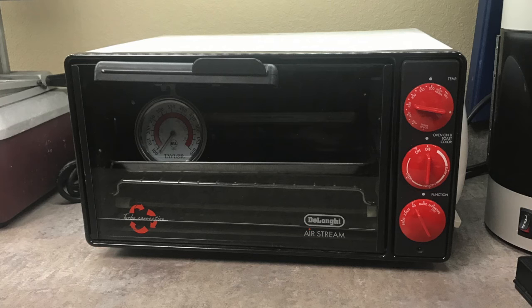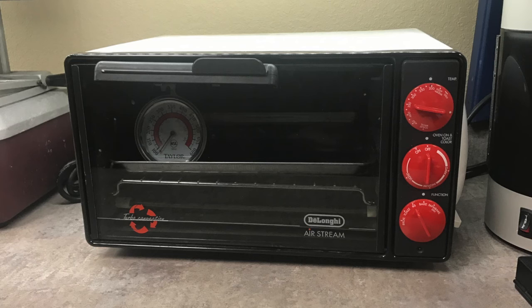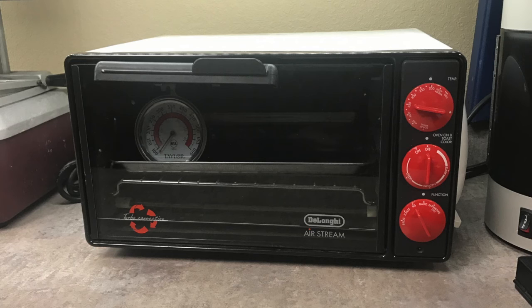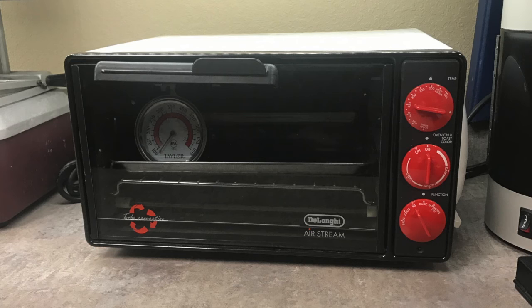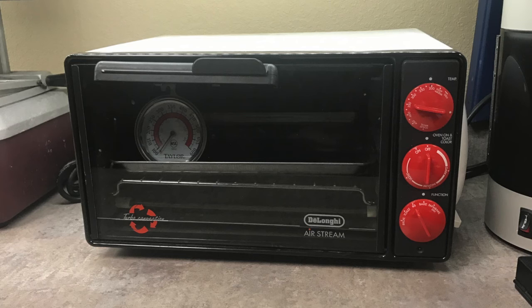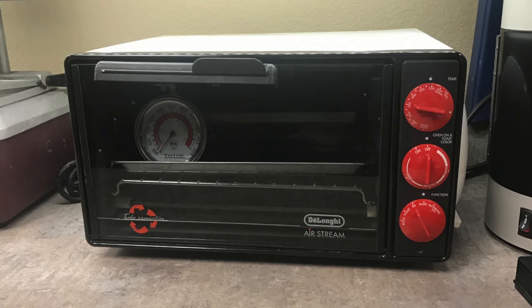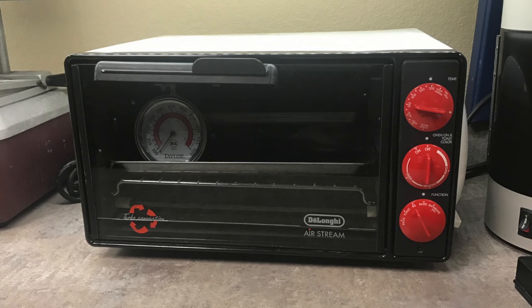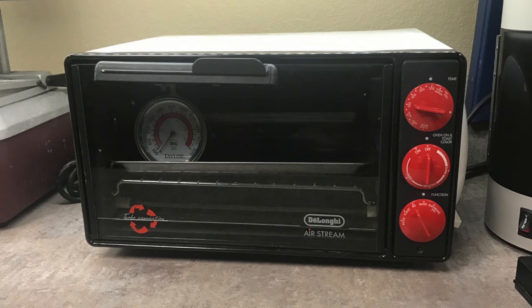The onlay is placed into any $20 toaster oven from Walmart to complete the curing process. The time and temperature settings need to be 250 degrees for seven minutes. The oven needs to be preheated and the temperature monitored with an accurate oven thermometer.